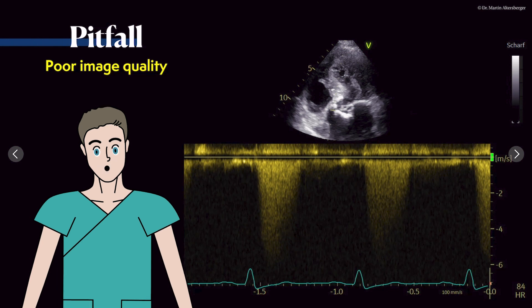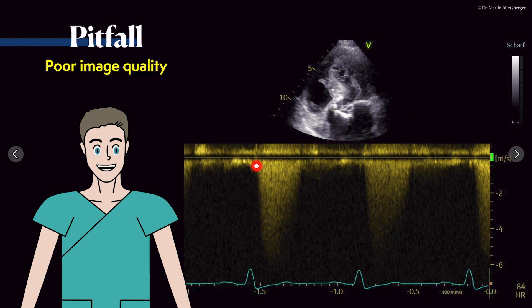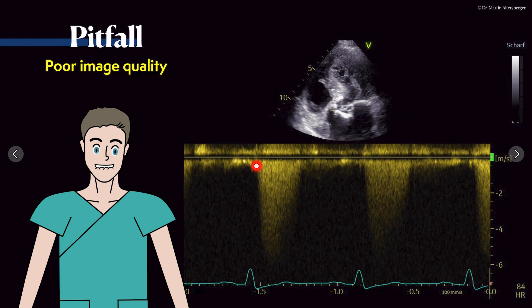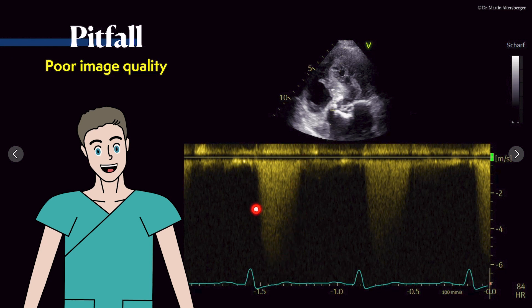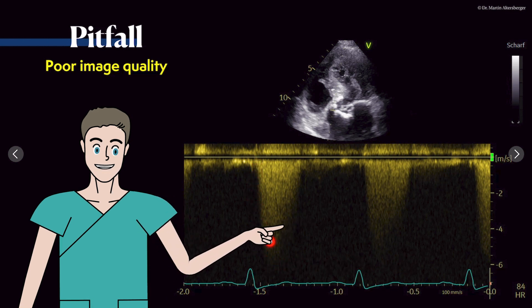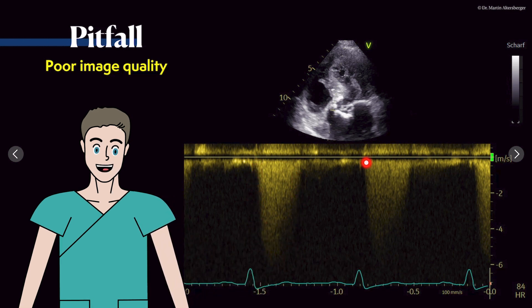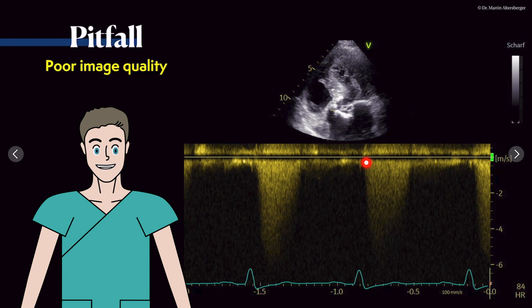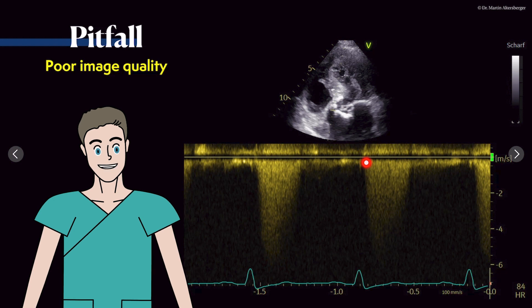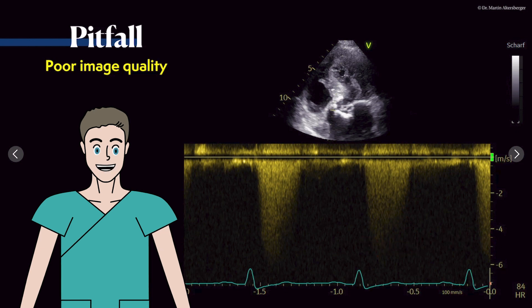There's another pitfall I want to point out: poor image quality. In aortic stenosis, or with any kind of valvular pathology, you need a really full signal — the entire signal has to have a nice bright spectrum. If that is missing or lacking, the signal is incomplete. Even if you have a high velocity, a relatively weak signal is not optimal. If you have such a signal — and you can also hear that it's not full — you have to measure again or find a better angulation. Here you also see an incomplete and underestimated signal.